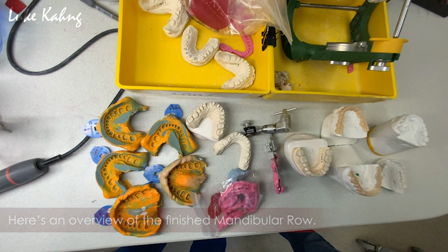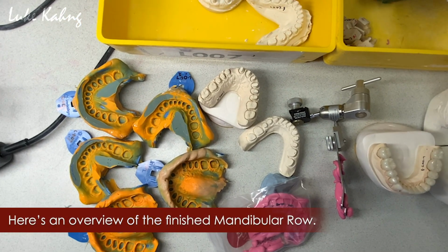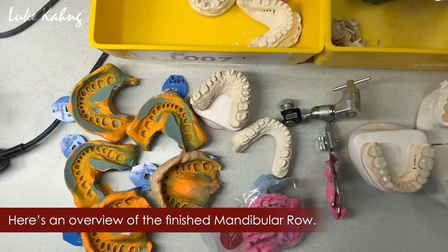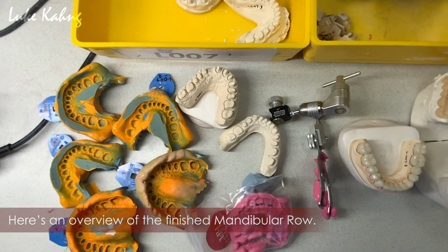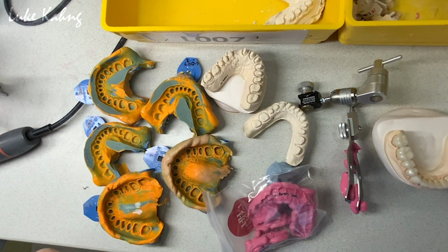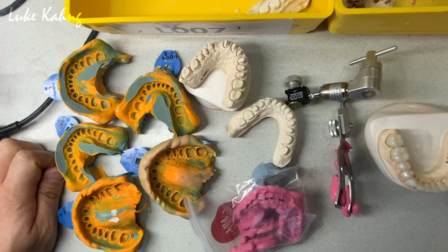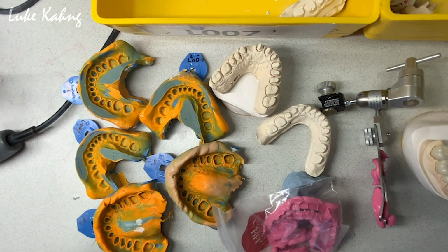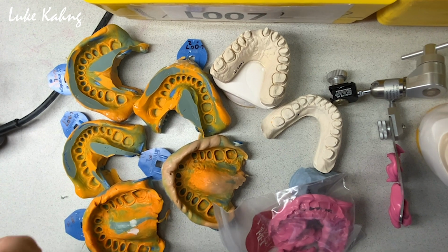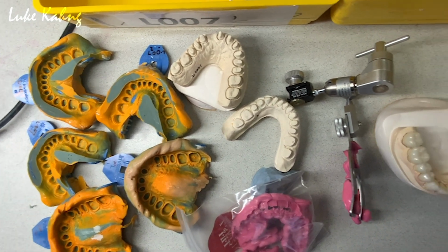Alright, I would like to talk about the great full mouth case, which is a 3 months planning regarding 28 teeth, and then one tooth we're going to do with one implant. So many dentists are asking how can we take the impression and also the bite record, which is very, very important. I would like to discuss these cases.